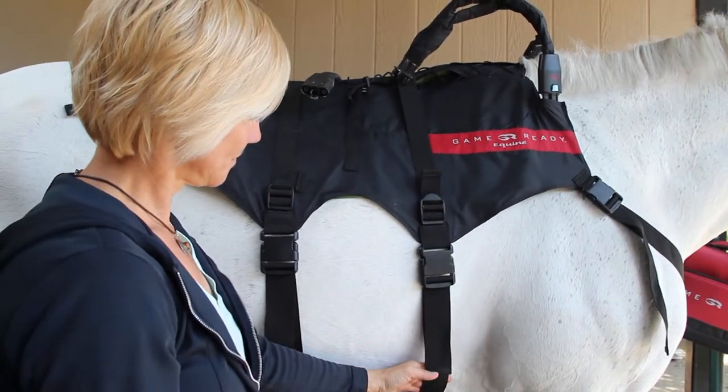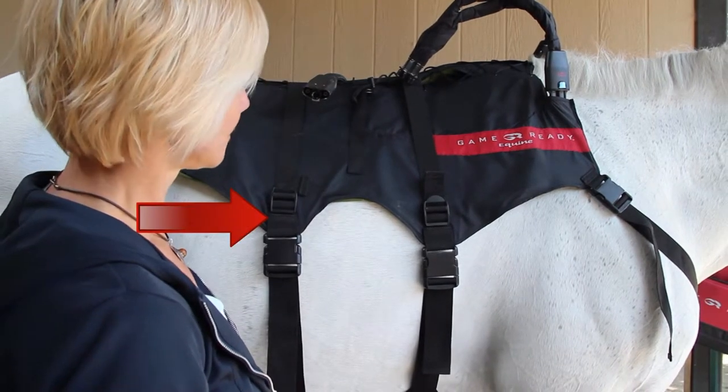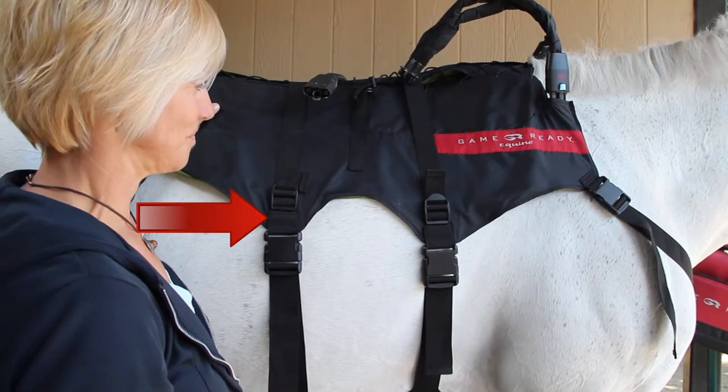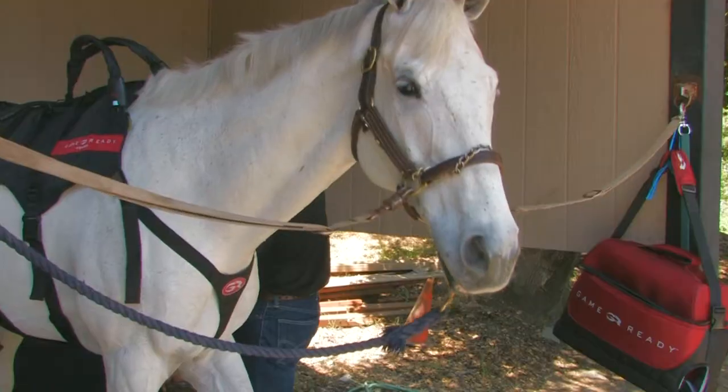The strap should be snug to the horse's belly, but not as tight as a girth. Follow the same protocol for the rear surcingle strap, carefully monitoring your horse's reaction. Do not proceed further until your horse appears calm and relaxed.